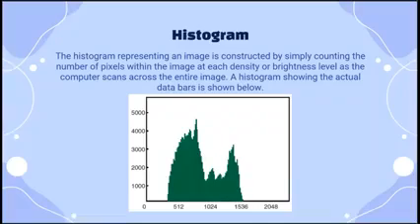Okay, each vertical bar indicates the number of pixels which hold the gray level indicated along the bottom axis of the graph. The peaks and valleys. Okay, when we say peaks, those are the highest, and then the valleys are the lower ones. Okay, of the graph represent variations in the anatomical structures in the image. These are presented on a simple scale of brightness from white to black, as read from left to right.